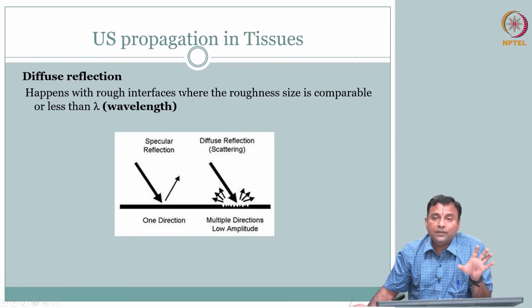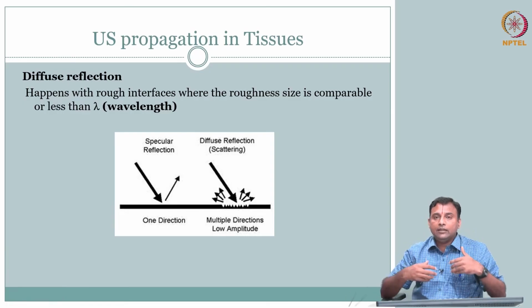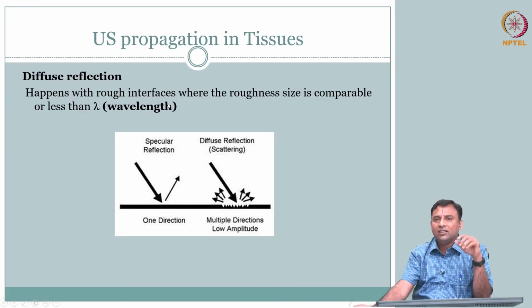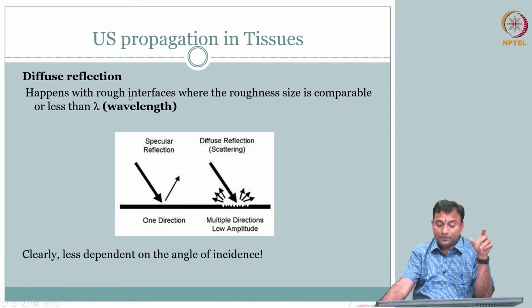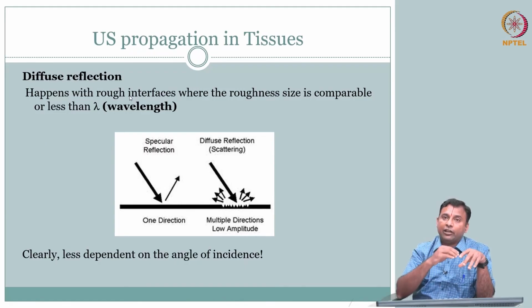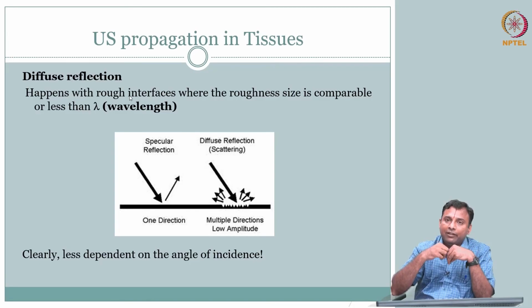So scattering is important, because it turns out when we talk about an organ, we talk about the outer interface that we talked about when we calculated our R. That is only specular reflection, which is okay, but predominantly the object itself, the liver or all the tissue itself, you can think about it as having very small acoustic scatterers spread in the body.